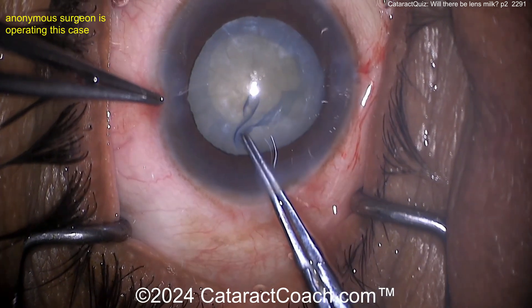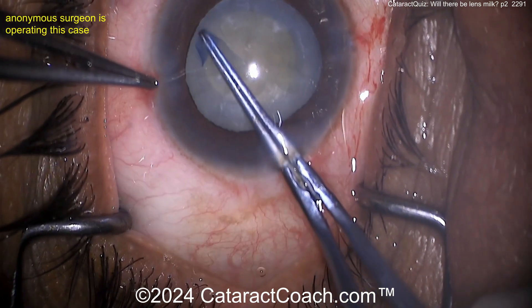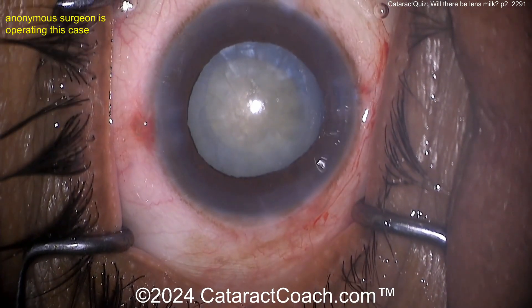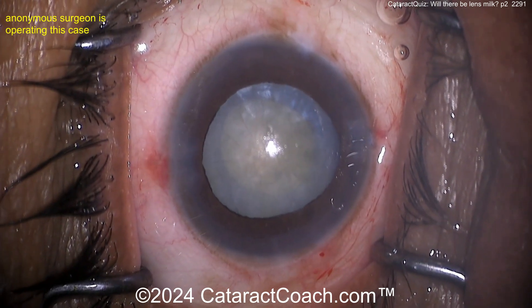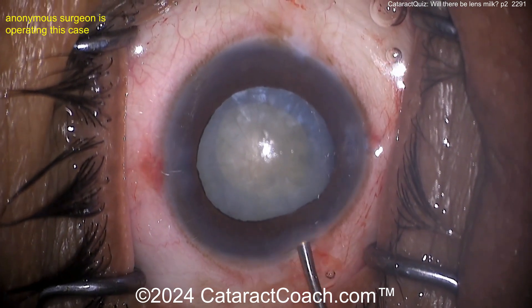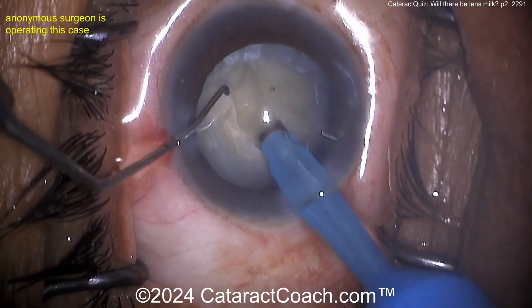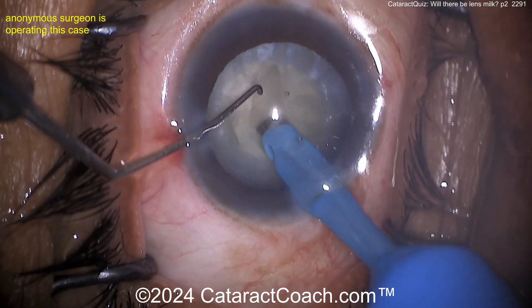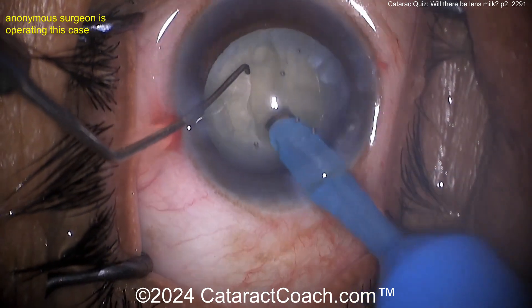Getting the rhexis nice and juicy. I just wonder about the lids though — I don't see any drapes at all. I just see the actual lid margin exposed to the field. Maybe that's okay — if you had a big bath in betadine or povidone-iodine. Okay, here comes a groove down the middle, chopping or cracking it.